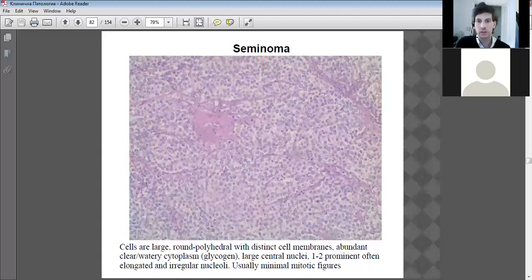Irregular nuclei, irregular shapes. The nucleoli aren't that easily seen, but there's one irregular one there. Good one there, normal round, elongated nucleoli. So mitosis is occurring, but in a not so normal fashion.